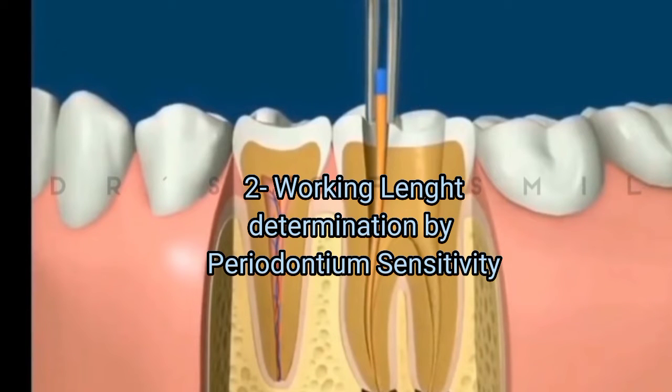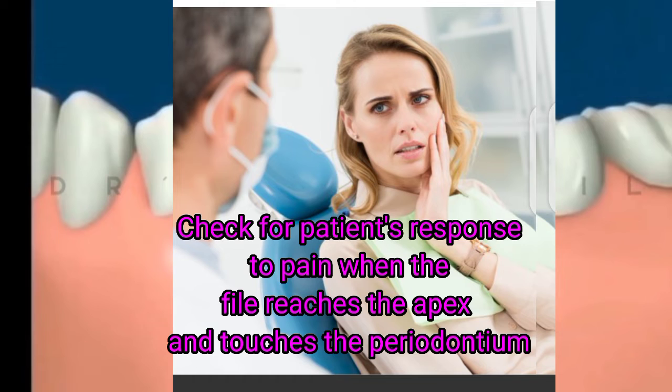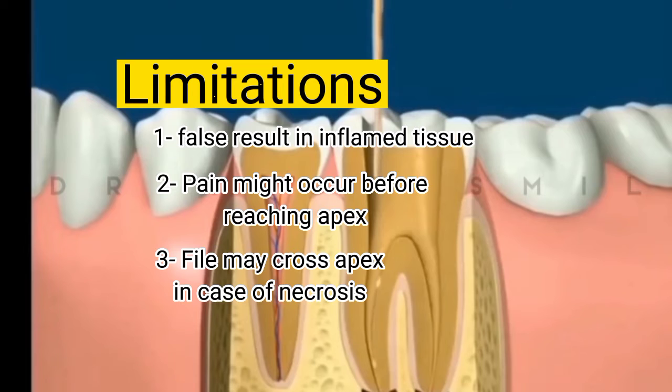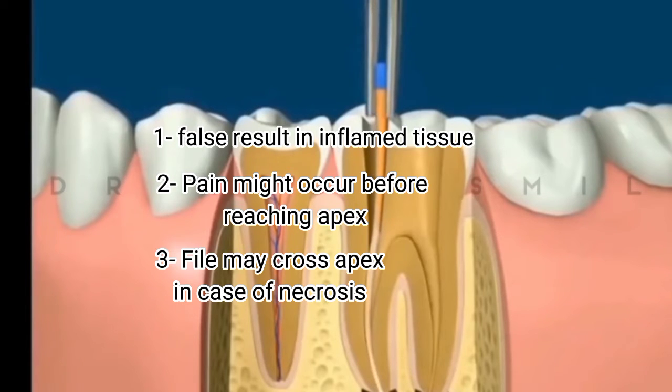The second method of detecting the non-radiographic working length is the periodontium sensitivity method. This method is based on painful response from the patient when the file reaches the working length across the apex and touches the periodontium with the K file. In this method, we intentionally cross the apex to reach the periodontal ligament and carefully watch the patient's response towards the pain. The problem with this method is that it gives false results in inflamed tissue. Pain might occur before reaching the apex, and in case of a necrotic tooth, the file may cross the apex without any pain.